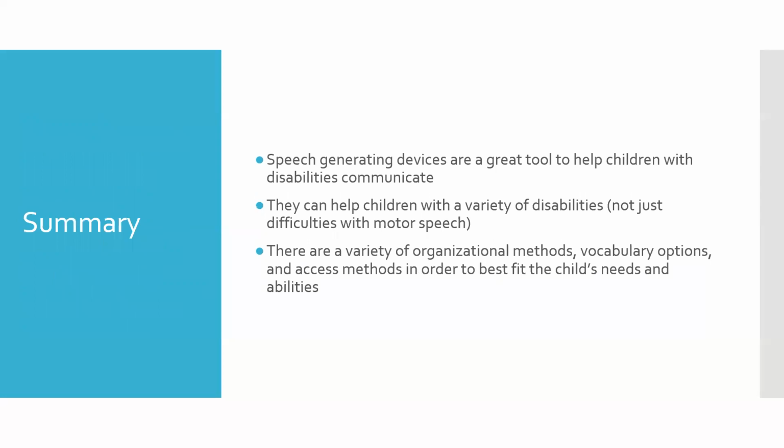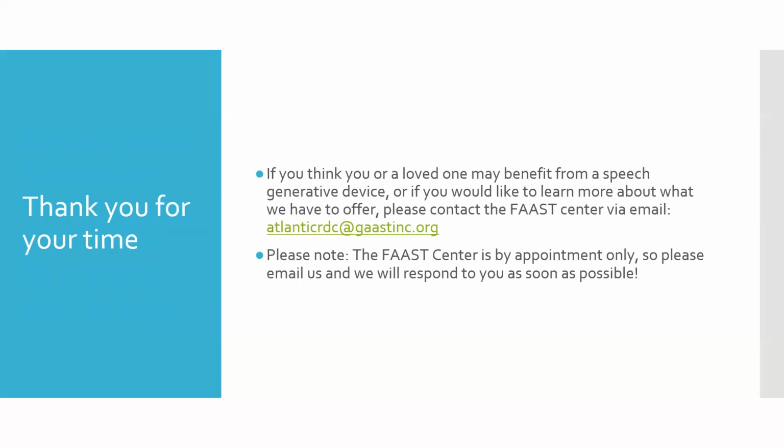So, to summarize today's training, speech-generating devices are a great tool to help children with disabilities communicate. They can help children with a variety of disabilities and not just difficulties with motor speech disorders. There are a variety of organizational methods, vocabulary options, and access methods in order to best fit the child's needs and abilities. And that is the end of the training.